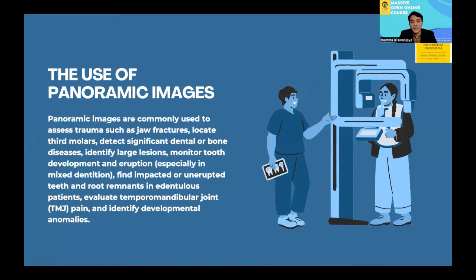Panoramic images are widely used in various clinical scenarios. They are essential for assessing trauma, locating third molars, detecting significant dental or bone diseases, identifying large lesions, monitoring tooth development and eruption, especially in mixed dentition, finding impacted or unerupted teeth and root remnants in edentulous patients, evaluating temporomandibular joint pain, and identifying developmental anomalies.